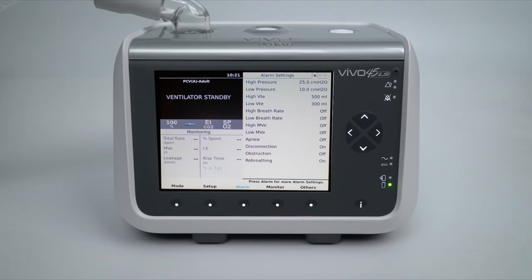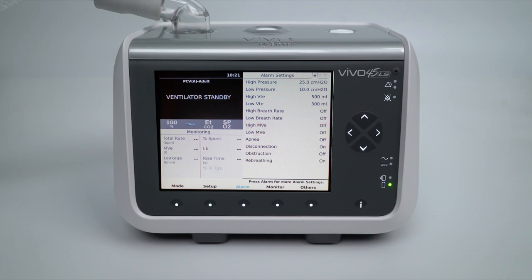Standard ventilation alarms are located on the first page. Among those are the high and low pressure, volume, rate, and minute volume alarm settings.